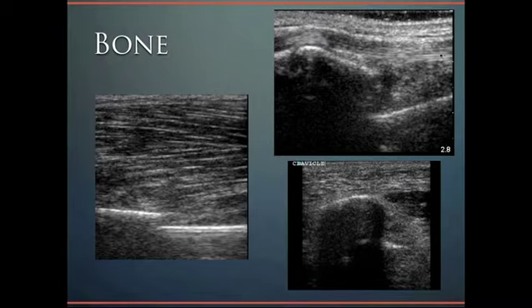In this particular patient, we can also make out the anisotropy seen on this area right here of its tendon, appearing falsely hypoechoic compared to this tendon portion and this tendon portion here. We would expect the tendon to continue to be hyperechoic, however, because of anisotropy, we see it's hypoechoic here. And then down here with the clavicle fracture, one part of the clavicle is here, there's a step off, and then another part of the clavicle is seen down there.